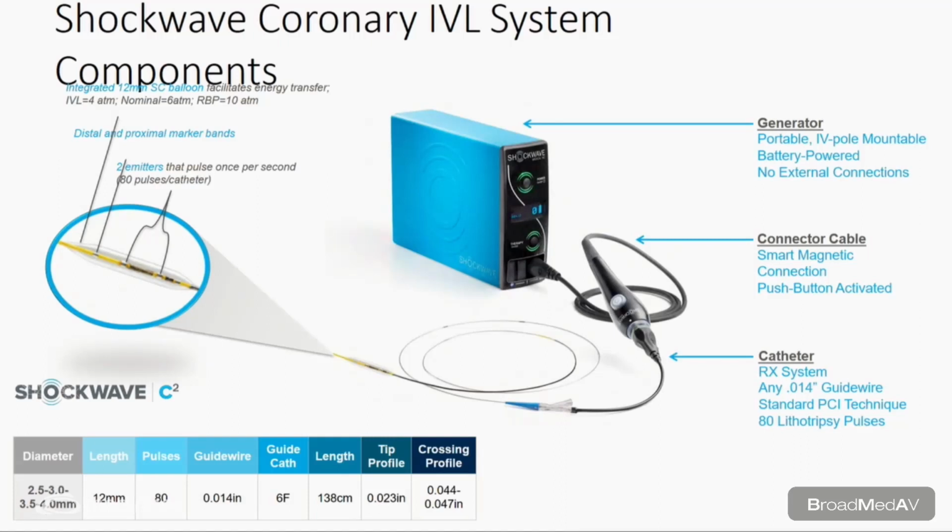And the device we are going to use for this particular calcified lesion is intravascular lithotripsy. Over to Dr. Ajit. Good morning. What we're going to show you first is a very critical left main. Can we run the angiograms of today? So we have a bilateral access, right femoral artery 7 French, left femoral artery 6 French. Why 6 French on the left? In case there's a requirement for an intra-aortic balloon pump, we can put that in.